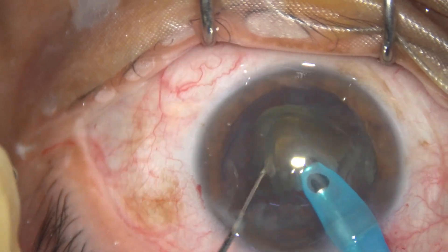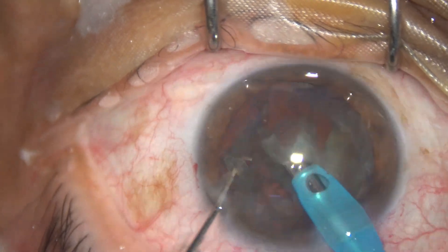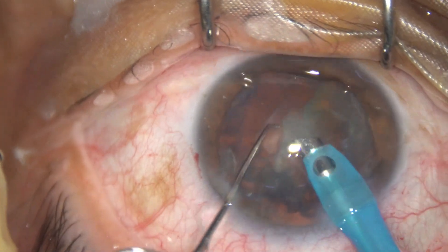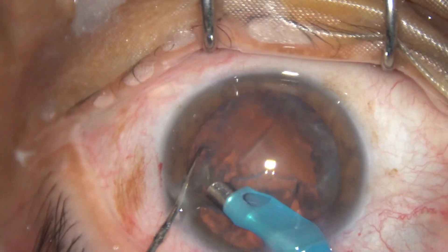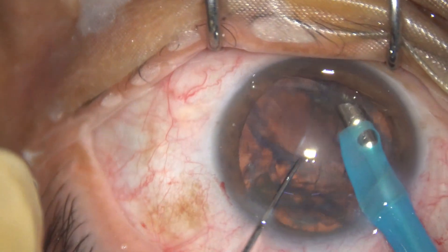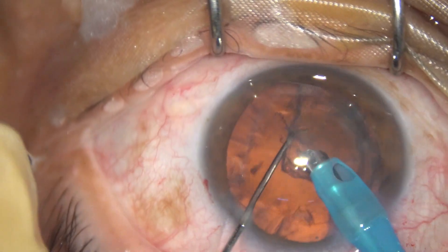The idea of this Prechopper is to use less ultrasonic energy so that we get a very clear cornea the next day. This is the epinuclear shell — it can be removed easily.